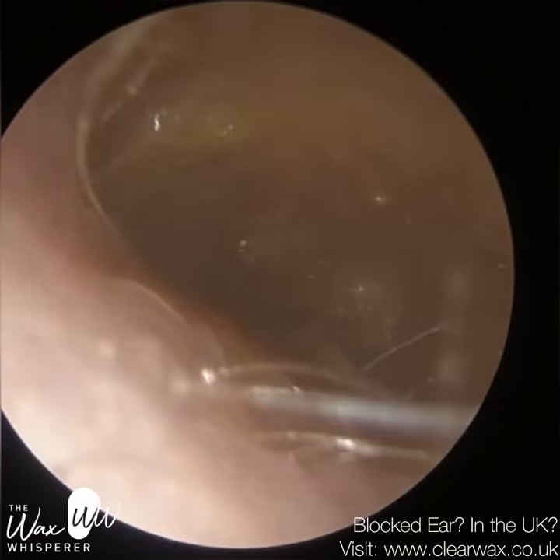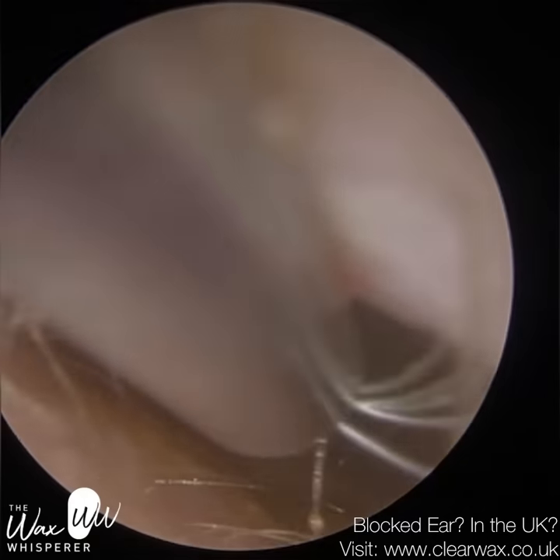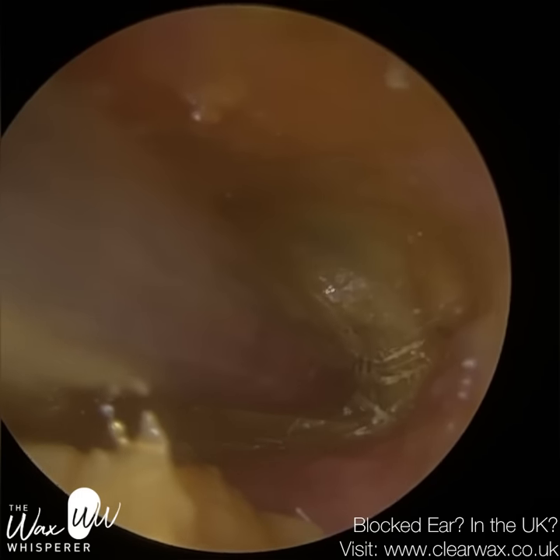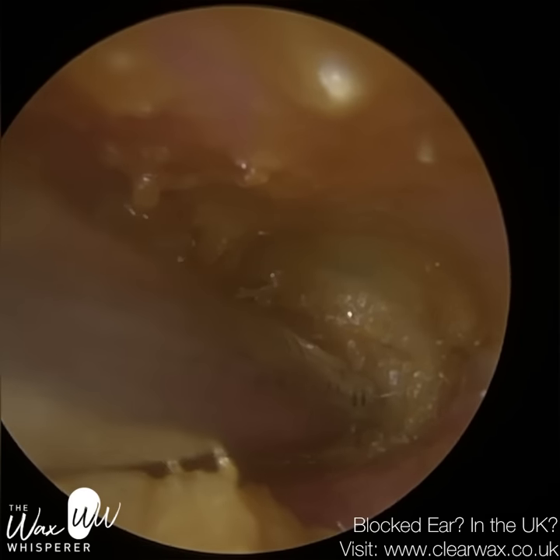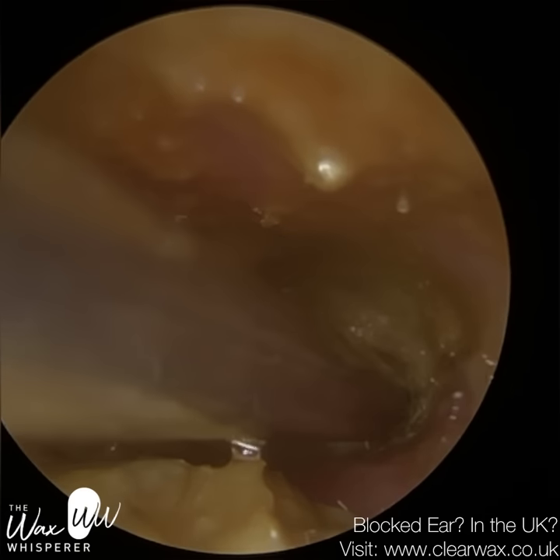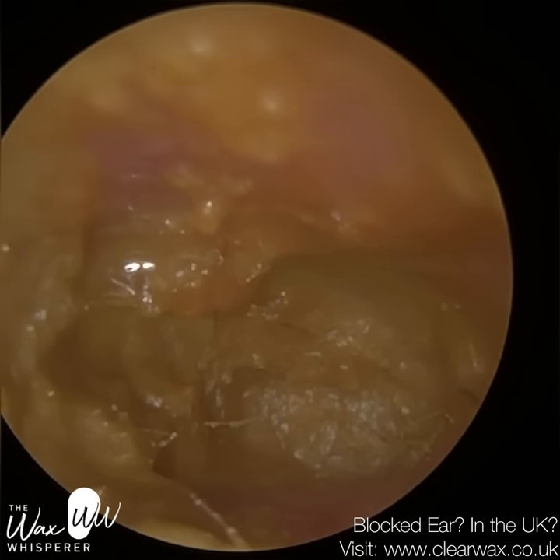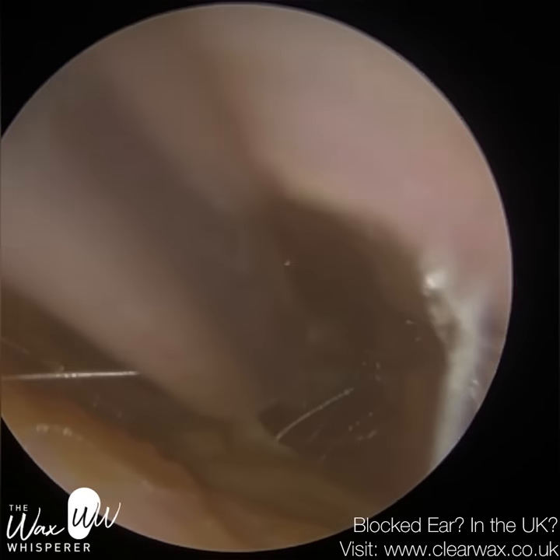So we're just working on the eardrum, using a lot of olive oil drops here just to change the consistency — because it's mushy, you want to bind it together. I'm using the fine end and I can see a hint of the eardrum around two o'clock. I can see a bit of a blue pearly appearance coming through this debris and I'm just kissing the surface. I'm half ready to come away if it becomes uncomfortable for the patient — I just don't want to make it an uncomfortable experience.